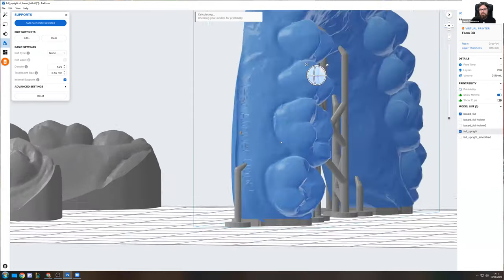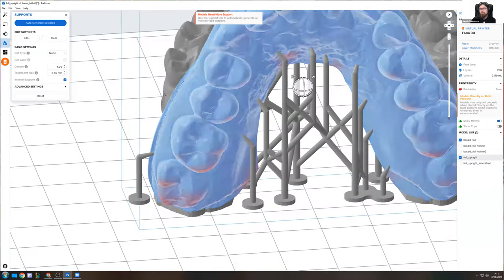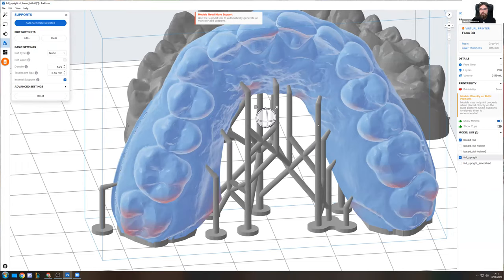And this is something, again, that is basically your choice. A lot of people will opt for the automatic support generation, then cut out a couple of supports where they don't think they need them. But there are also quite a few people like me who go into the edit mode from the get-go and just add the supports where they think they need them.